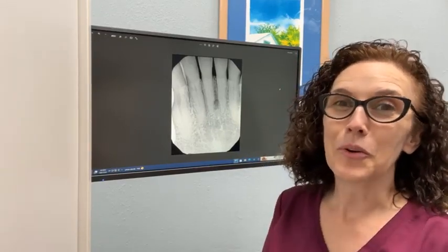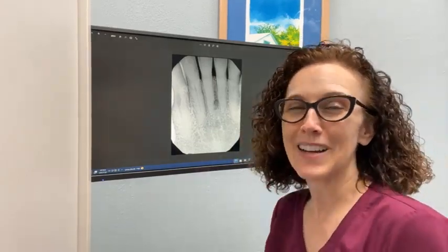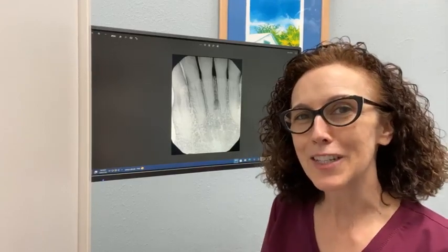So really cool. I thought I'd share it with you. It may not be interesting to you, but I think it's pretty neat. And I love sharing things like that with my patients.